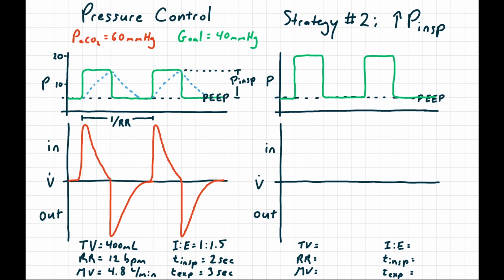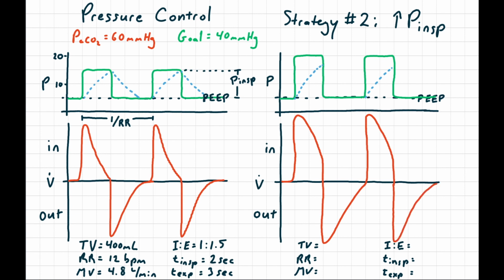Our pulmonary pressure will rise a little bit faster because now we'll have a higher flow rate. We can draw that higher flow rate based on the difference between circuit and pulmonary pressures. We'll have a truncated inspiration here, but you can tell that the tidal volume is still increased significantly. The same thing repeats again for the next breath.